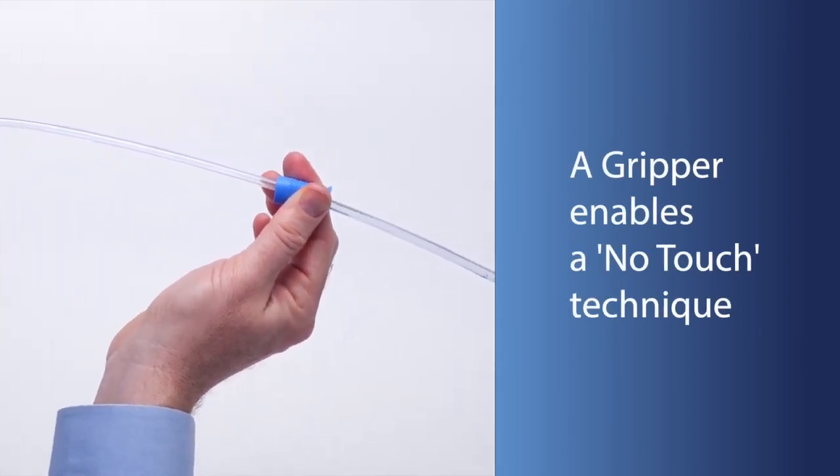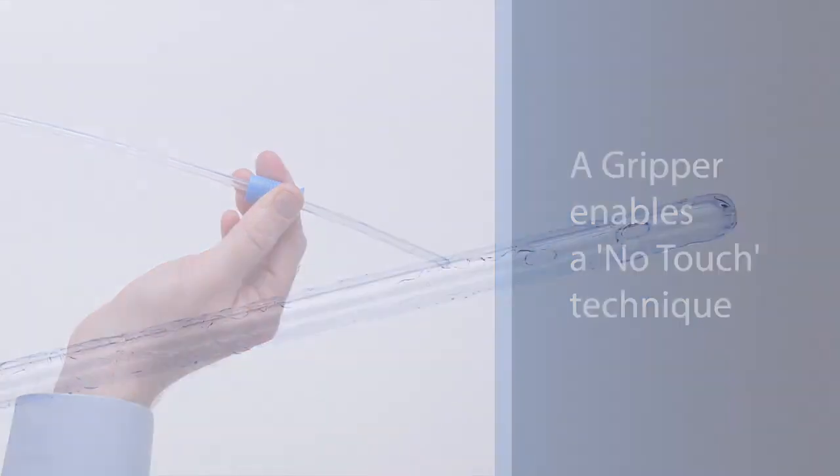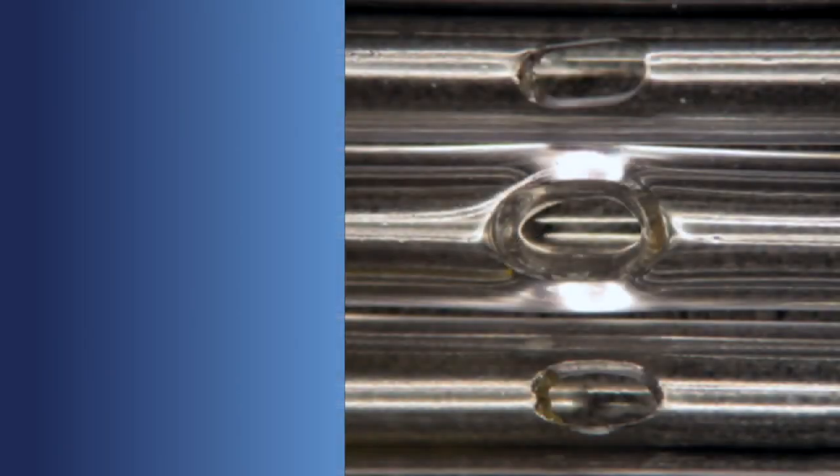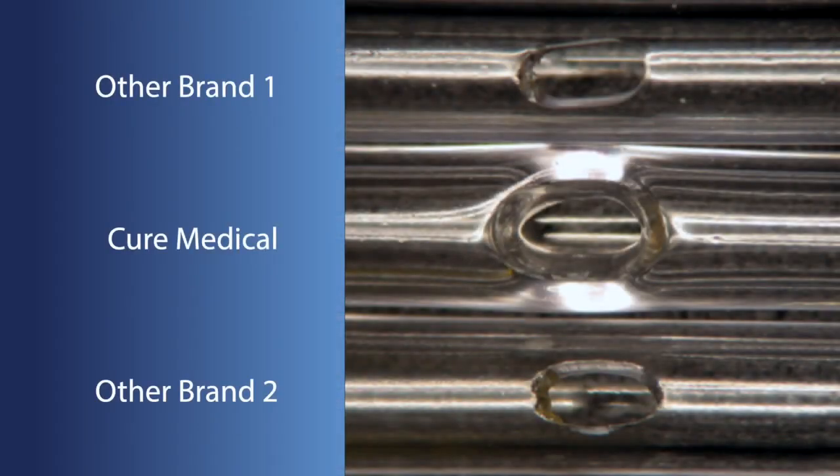The pre-lubricated Cure Ultra catheter tip features smooth, polished eyelets for comfort. This magnified image shows an eyelet on a Cure Medical catheter compared to eyelets on two other national brands. The difference in eyelet quality is clearly seen and can be felt.